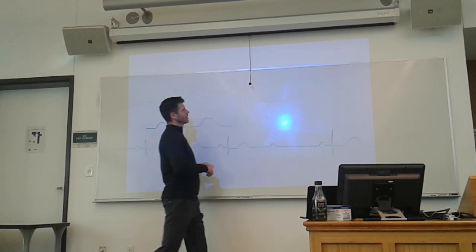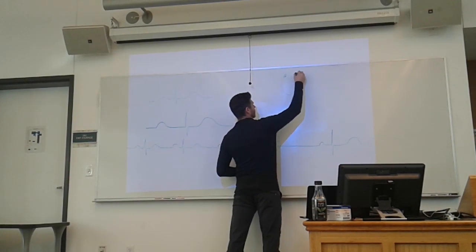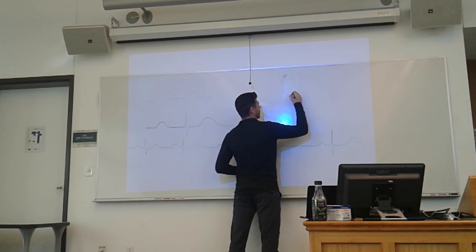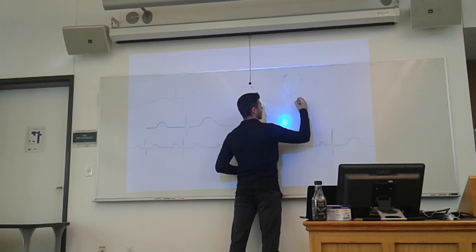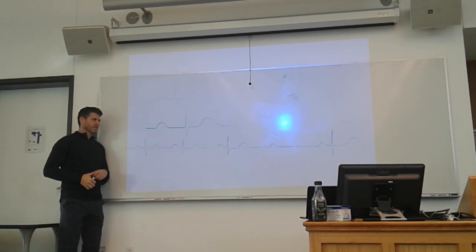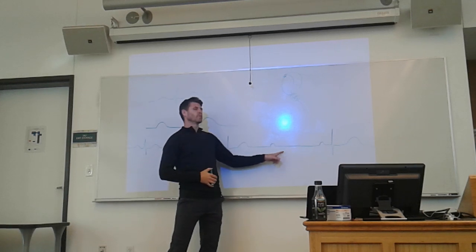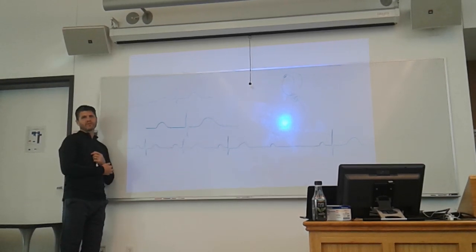Okay. You want to ask him? You want me to ask him? I'll ask him. We have a question. Yes? If you don't have the QRS to cover up the repolarization of the atria, where would you see that? Usually the repolarization, the Ta wave, you probably won't see it because it is almost always so slight that we don't really see it.